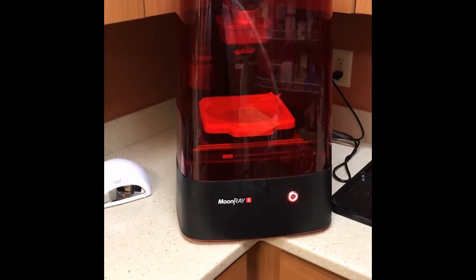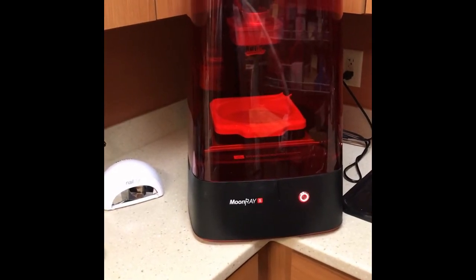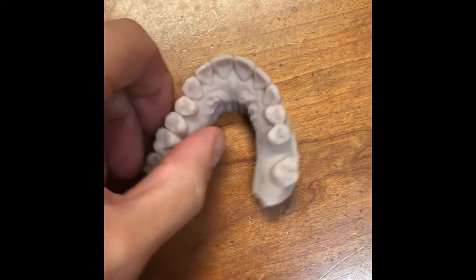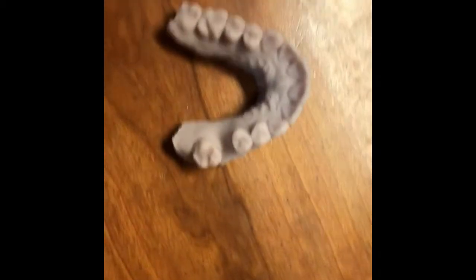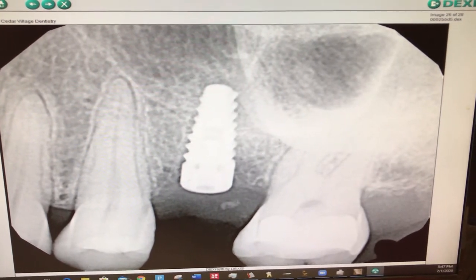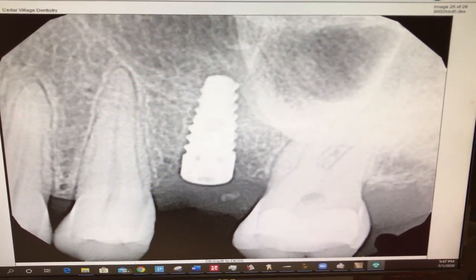After the implant is planned in our software, we utilize our 3D printer to print a model of the patient's mouth and a surgical guide to prepare for placing the implant. This 3D printed model shows the space we've been planning, and you can see the accuracy in the print. The surgical guide snaps into place in the patient's mouth so we can position the implant right down the middle. Here is the final photo of the implant exactly where we had originally planned — showing from start to finish how accurate this process can be.